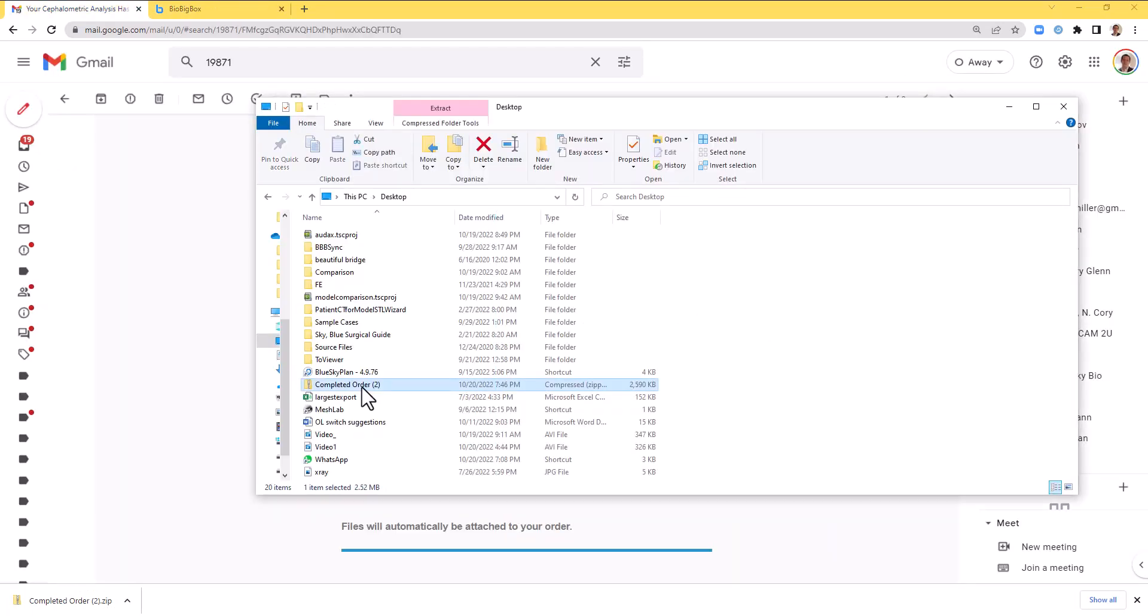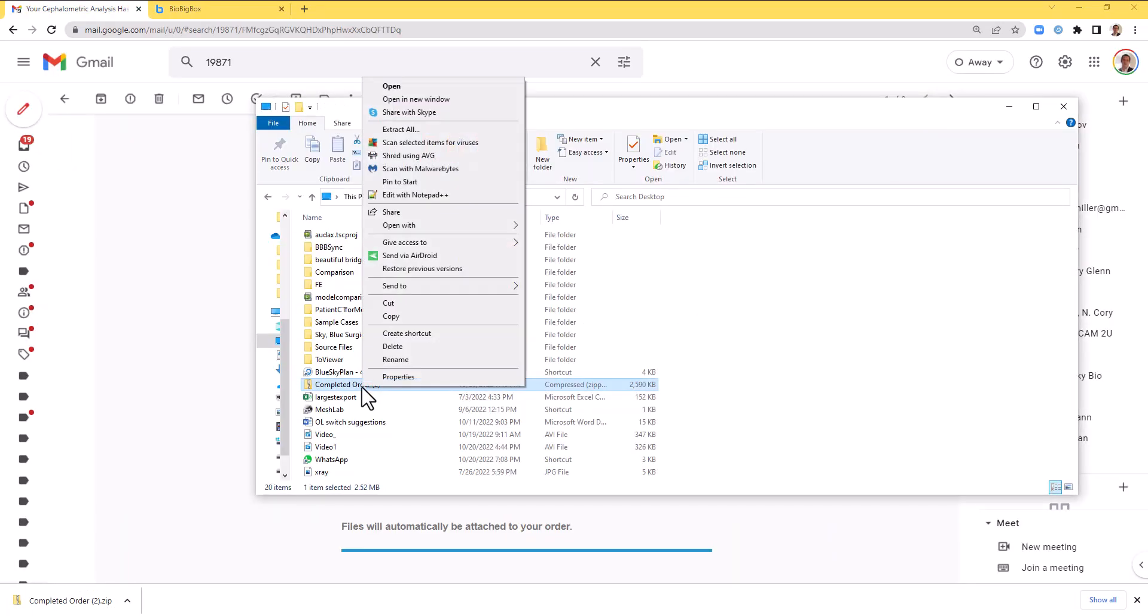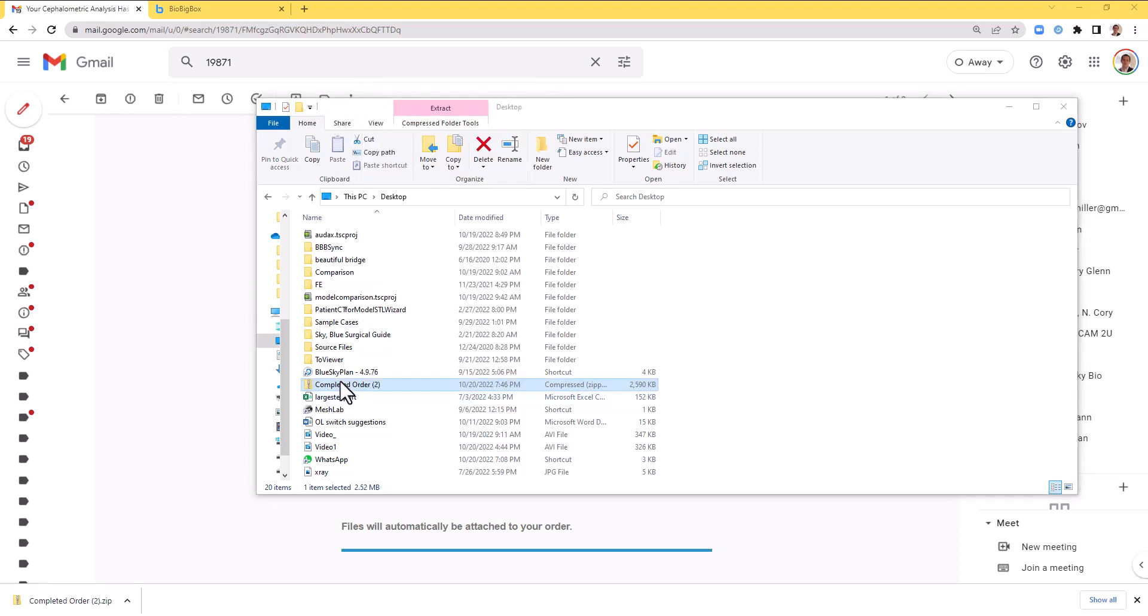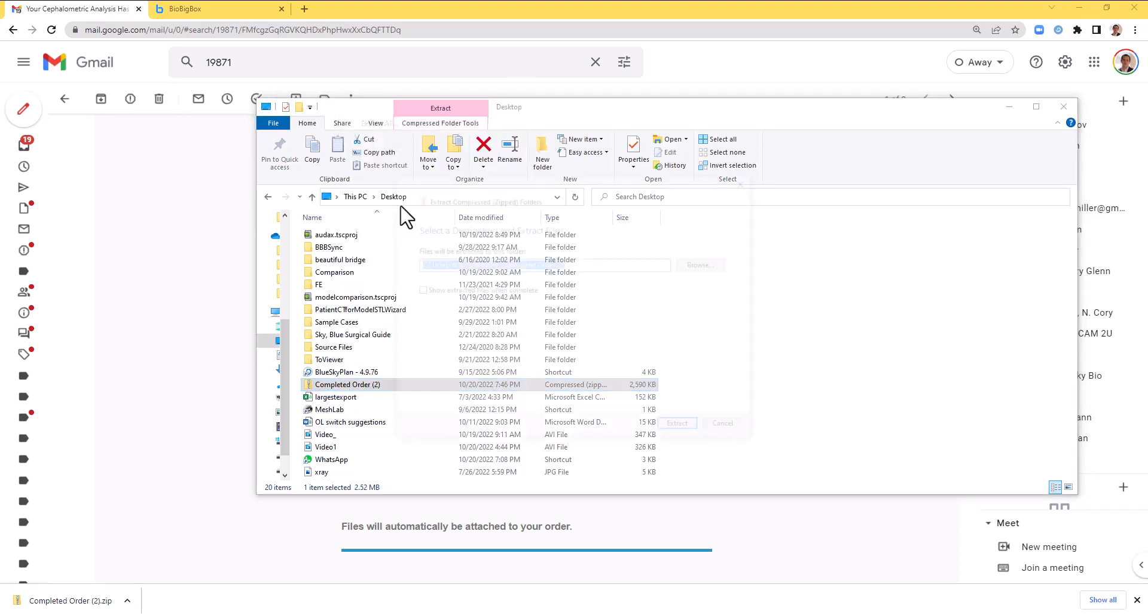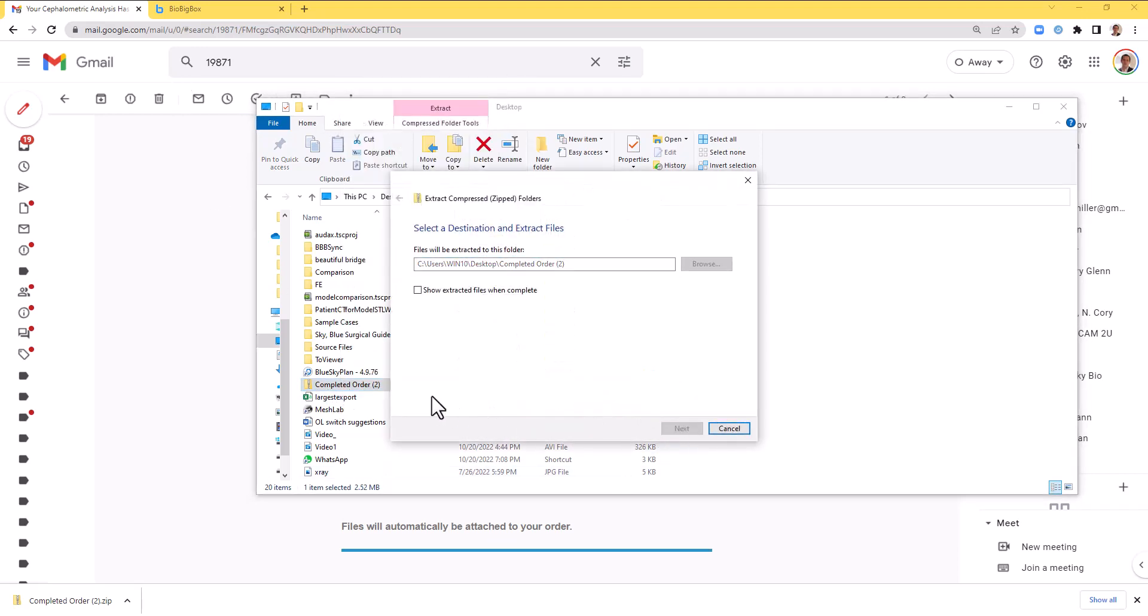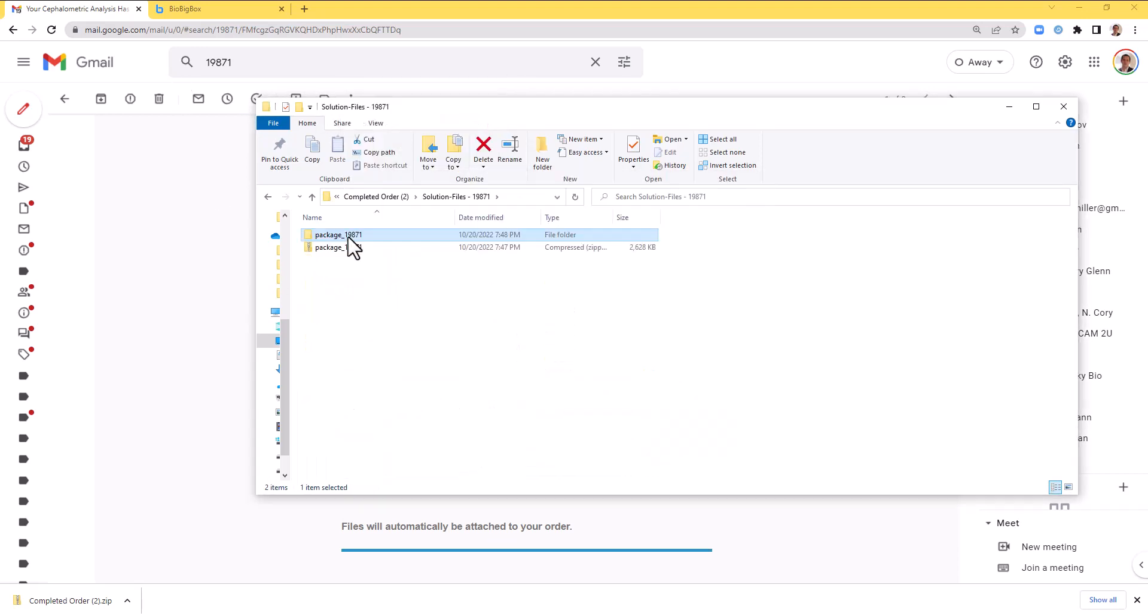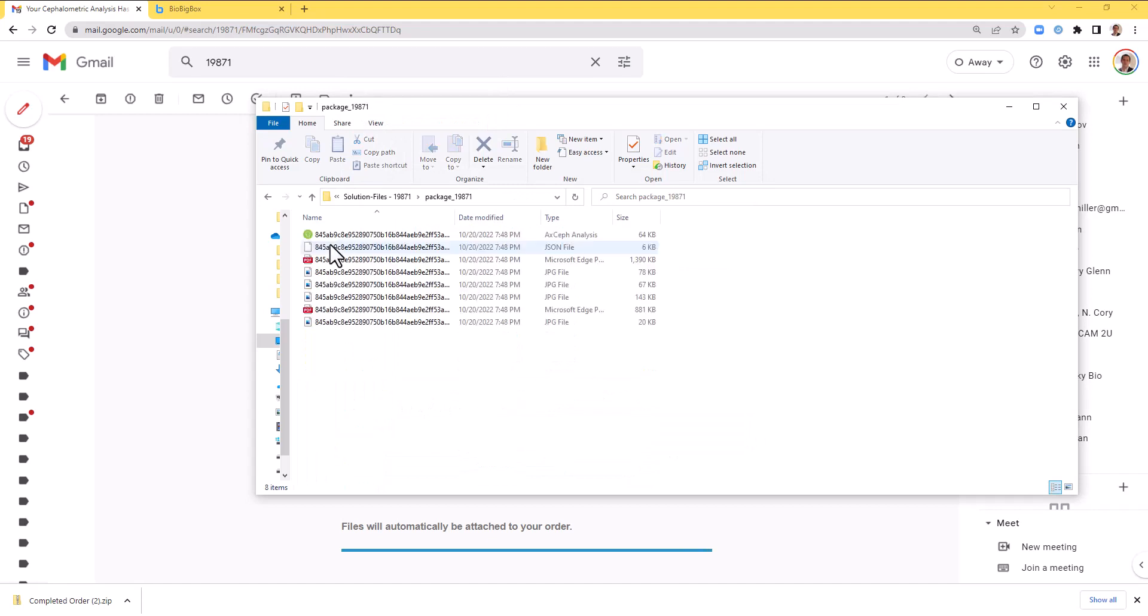I can now see the completed order on the computer. I will go ahead and extract all. I can see the files that have been returned from the order. What interests us are the PDF and the JPEG files. So if we go ahead and look through the PDF files first, for example.